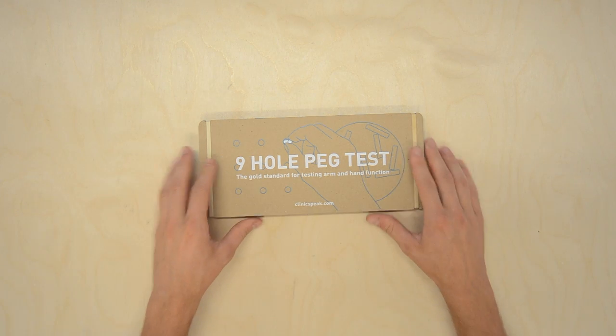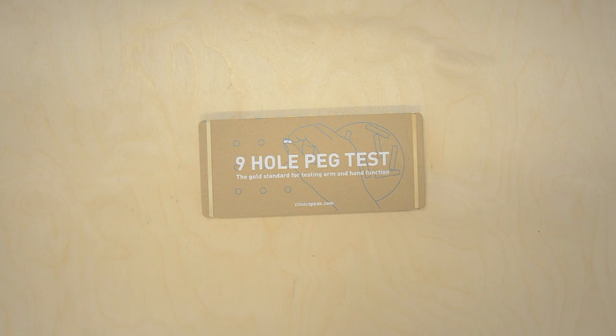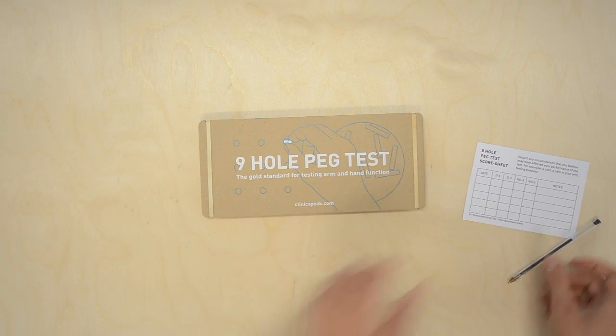You will need a 9-hole peg test, a stable table, a score sheet and pen, and a stopwatch.